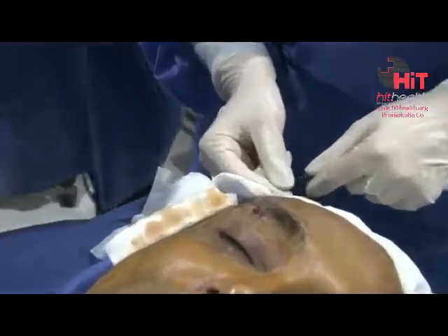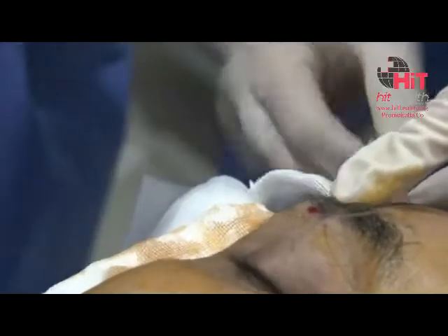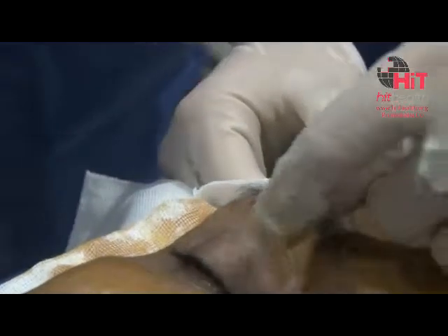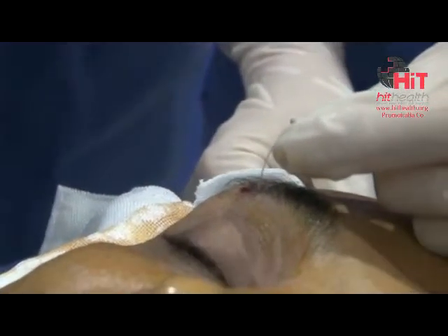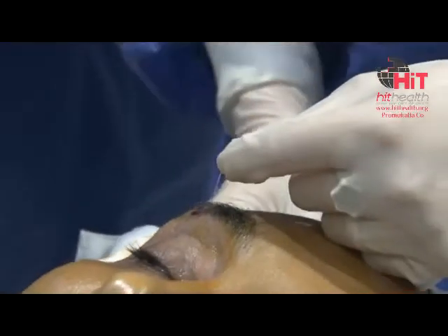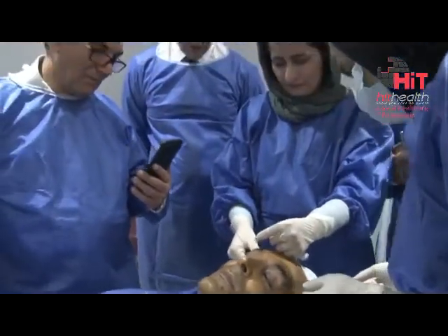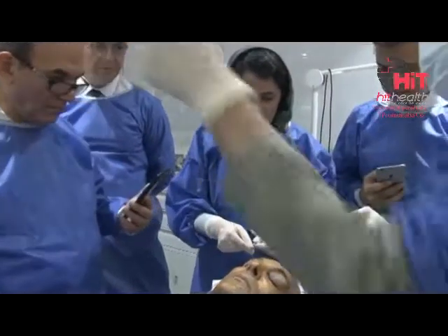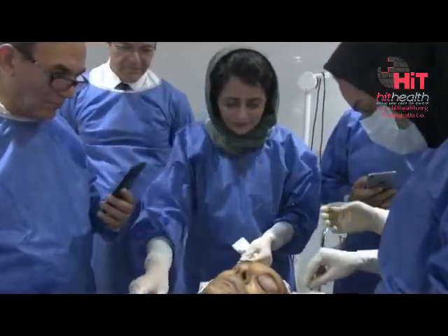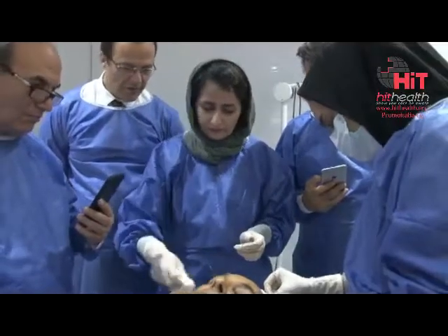What's your name? Salvatore — in Italian. Finished. Good job — the threads made a good job. A little bit more open and you can see less skin in this part. Very good job. But if you want the threads after one month, after two months, you can put another free float in the external part if you need. Fatima, pull and open — open the barbs — and make the seam the same. Cut, cut.